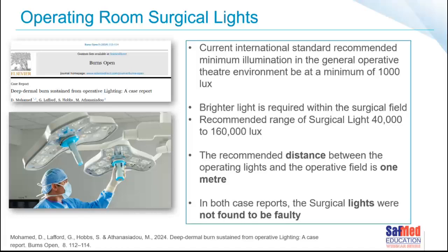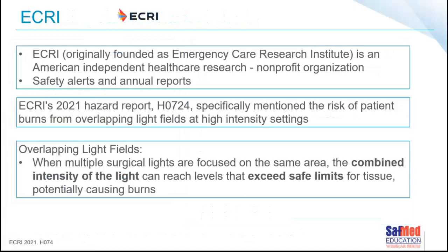And in both of these instances, there was nothing wrong with the surgical lights. They were not faulty. It was just how the light was used. So combining two light heads or a multitude of lights together shone into one particular area for an extended period of time has great risk to it, and the patient has the potential to develop a burn.